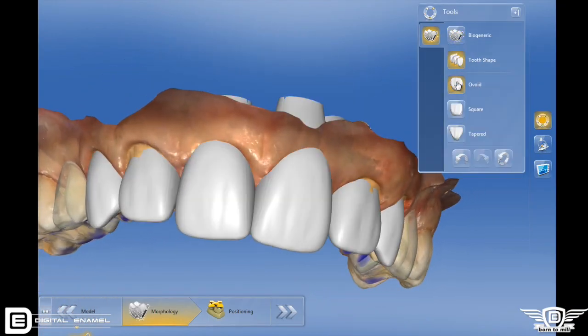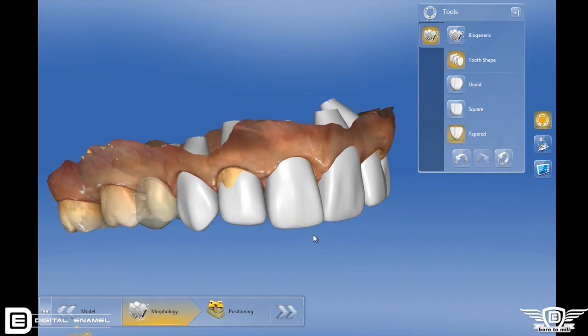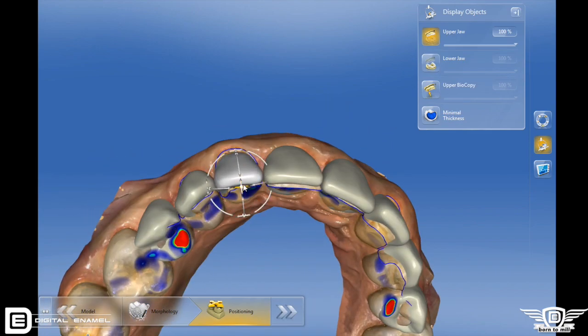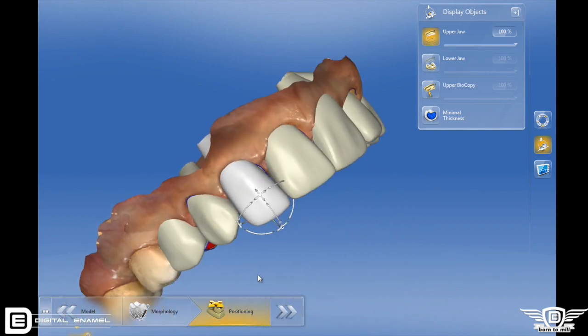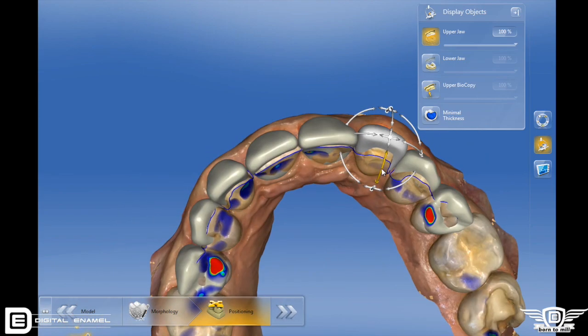One of the big advancements in 4.4 is called BioJaw. It's an advancement over the biogeneric calculation, which looked at the adjacent teeth and tried to match them as best it could. Now BioJaw looks at all of the teeth that you display to it. In the anterior, when you're using BioJaw, you have different options for shapes — you can select ovoid, tapered, or squared — giving you the opportunity to do more of your design within the software. With BioJaw and the grid overlay, you have a lot of power to make restorations extremely symmetrical in the shapes you feel best for the patient.